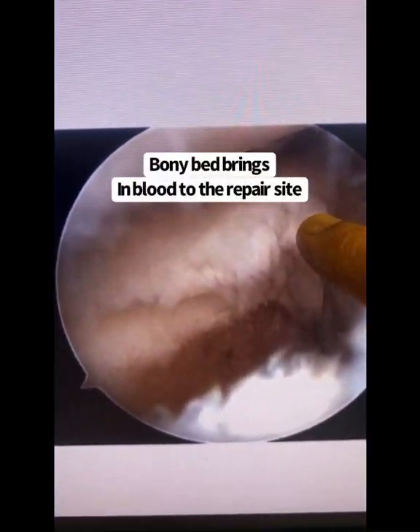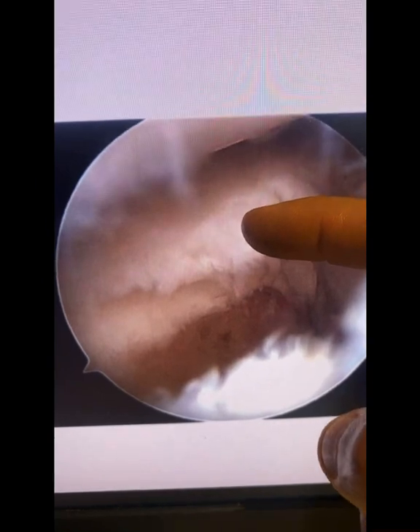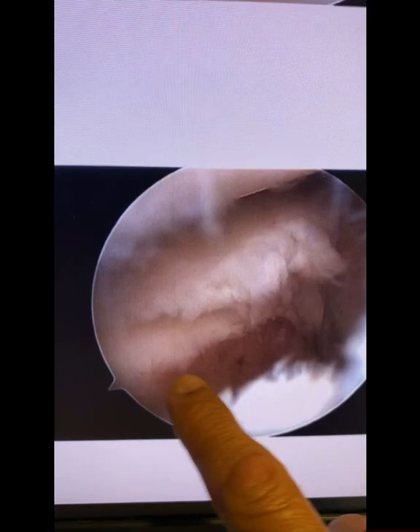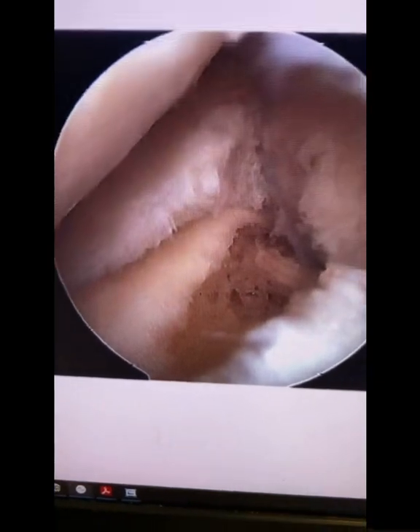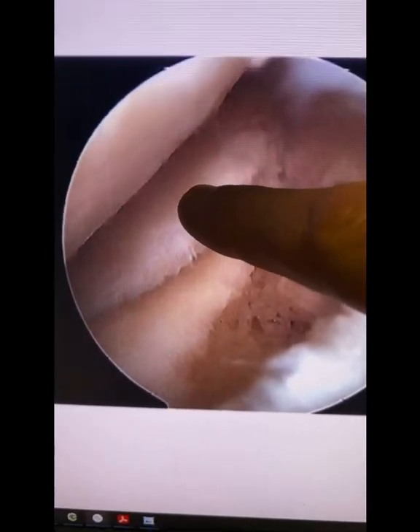Here is what it looked like before I operated, and here is what the preparation looked like. There's the meniscus in the back. I'm making a bony trough — creating a nice bony area where I will be planting the meniscus. I create a nice bony bed, and this is going to be the docking site. Preparation is complete.